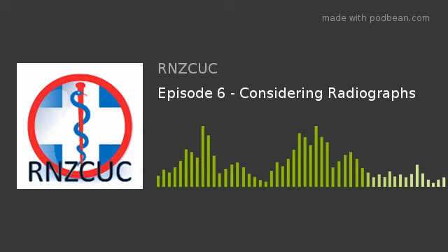So there's two sorts of laterals you can do. There's just a plain lateral, which involves the patient standing with their hand on their tummy, so their elbow's pointing out, I guess sort of like a chicken wing. Sometimes you describe it to them like that. You can perform this many different ways. You can perform it in an AP or PA position.